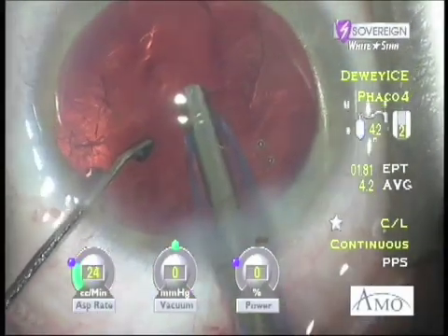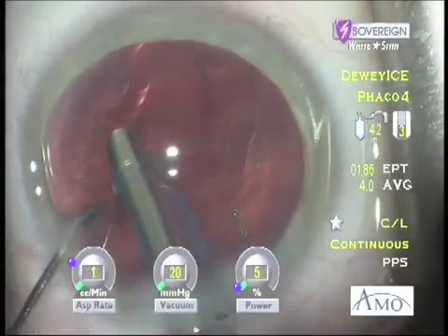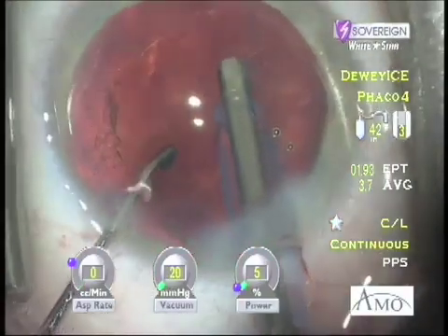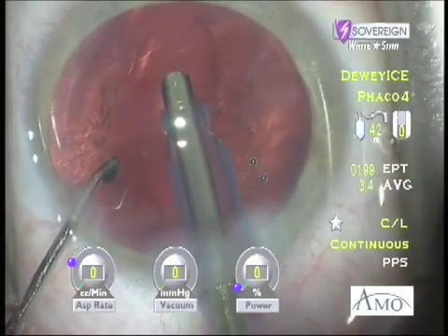Combining mechanical abrasion with vacuum stabilization and utilizing ultrasound, I simply rotate the FACO needle bevel down and aspirate the capsule into occlusion with the lumen. Depressing the foot pedal into position 3, the FACO needle is stroked across the capsule, gently removing not only the plaque but the fine cortical fibers as well. This capsule was wonderfully clear and the patient achieved her desired spectacle independence.